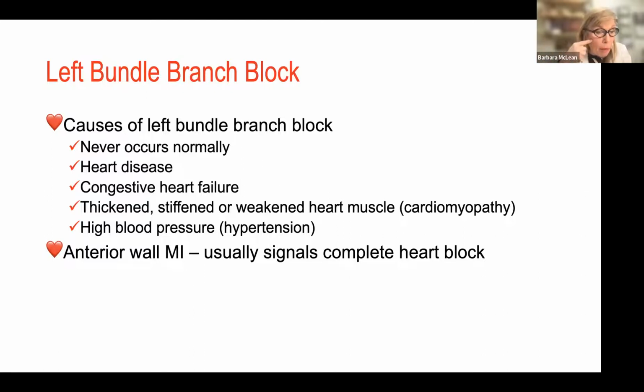But I want you to remember, if it's LAD, the LAD also supplies the right bundle. So your patient is profoundly at risk for complete heart block when this occurs, which is why you've got to be able to quickly look at it and make some assumptions. Maybe you need confirmation from a cardiologist, no harm, no foul, but at least notice it, because that patient may have an asystolic cardiac arrest. He goes into complete heart block, and you could have anticipated that because he was having anterior myocardial ischemia.